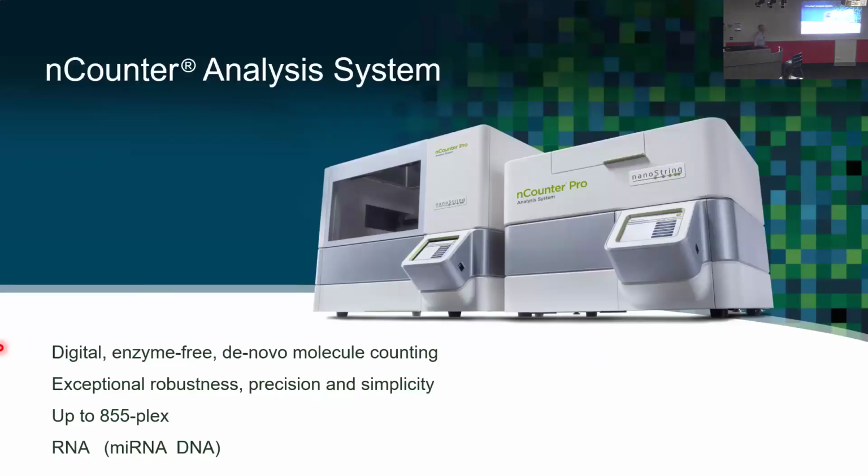Okay, so this is the platform I'm talking about. It's called the nCounter. Yeah, this is the nCounter. It comes in two parts. One's a robot that does a few things. It does liquid handling. It does electrophoresis, or electrostretching in this case. It does mag bead cleanup. It does a bunch of things, right? And the other one is essentially a microscope that's dedicated to looking at individual molecules.